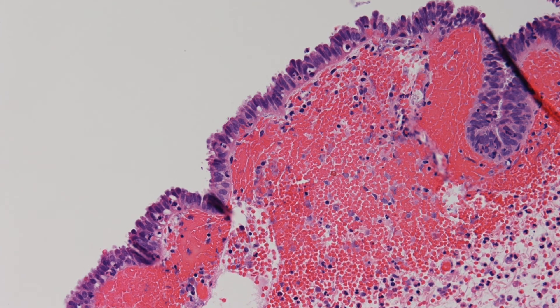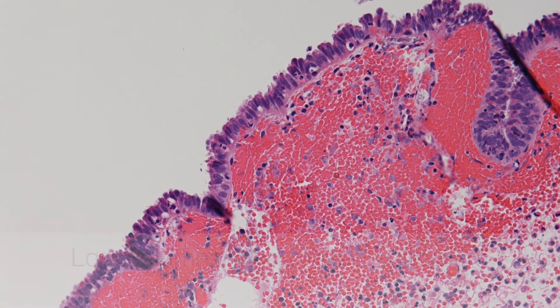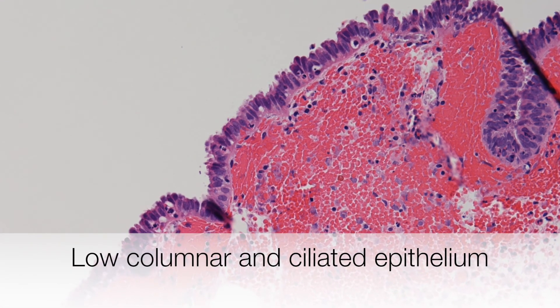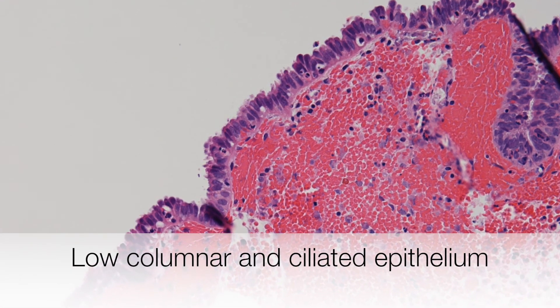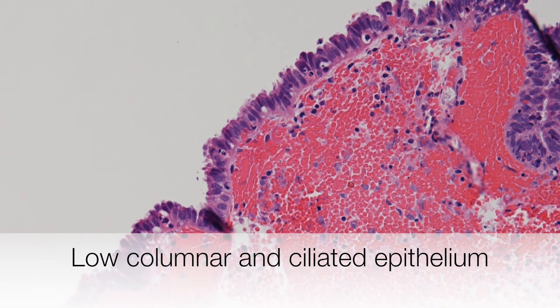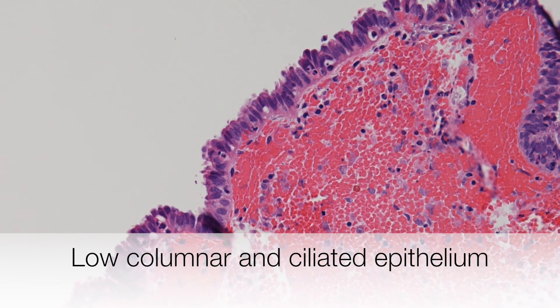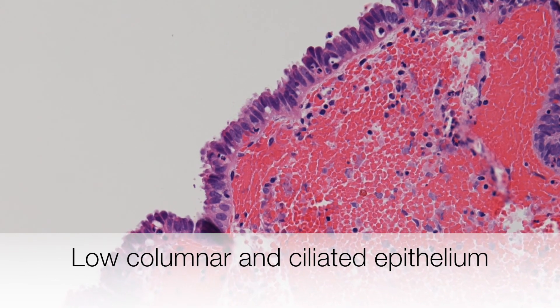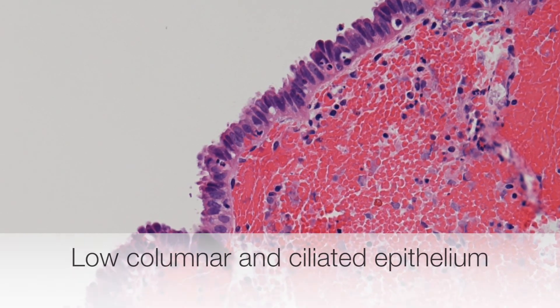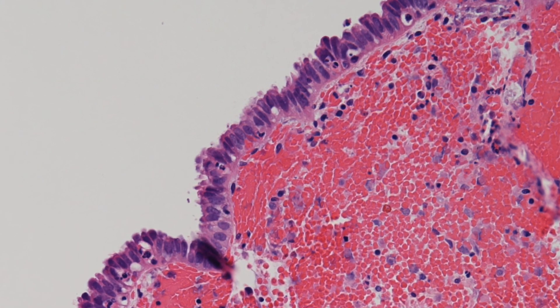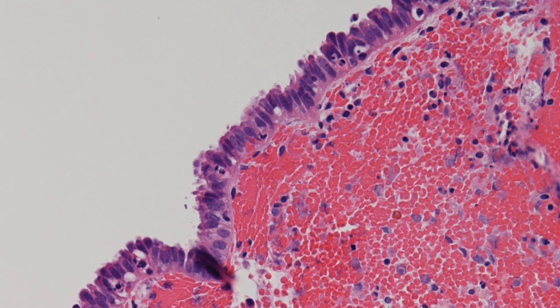This is the typical epithelium covering the appendix testis — here it is low columnar and focally ciliated.